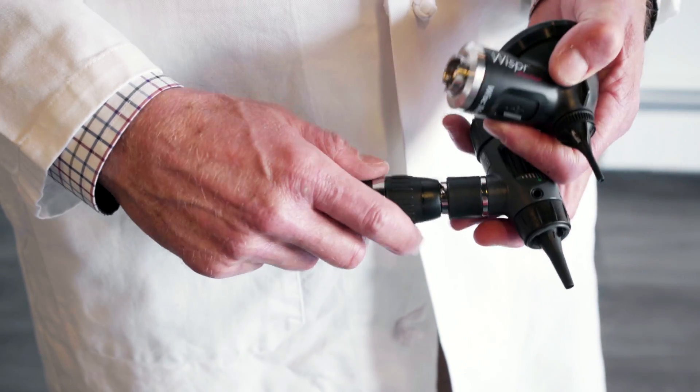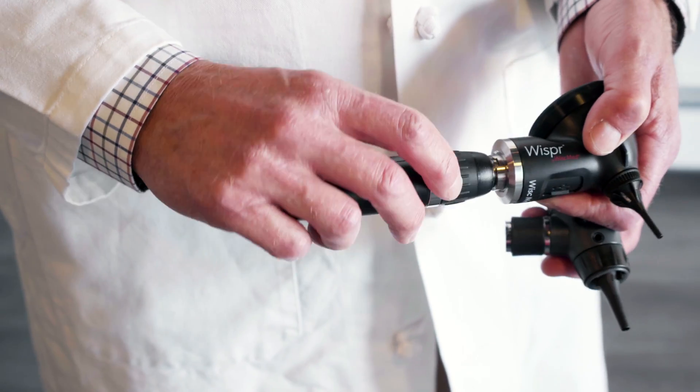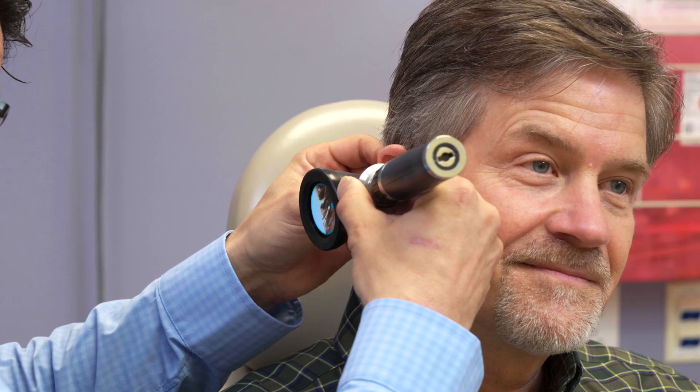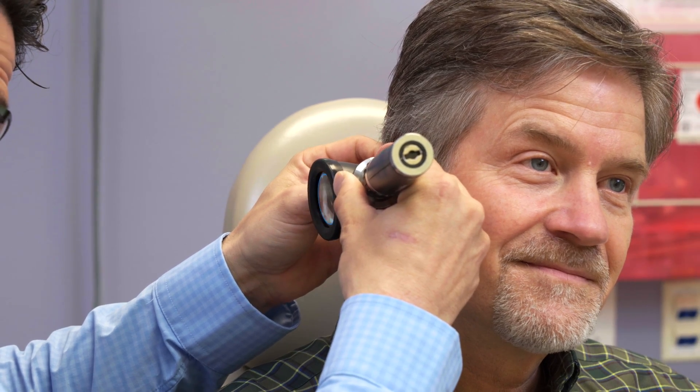One of the great things about the Whisper is that it's as simple as taking off the head of the old device and putting on the new one, and now it's right in your normal workflow. The functionality is just really familiar.